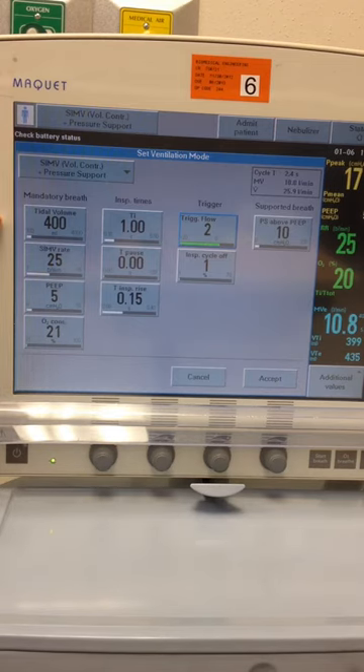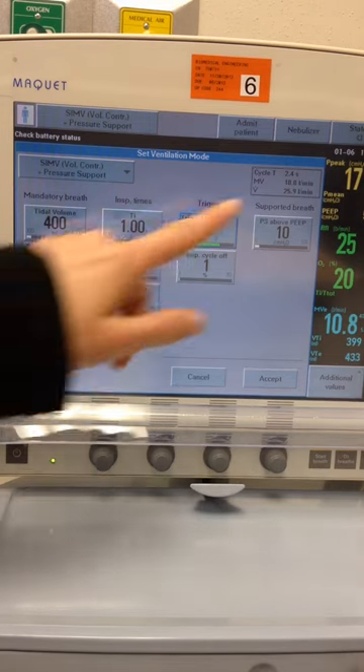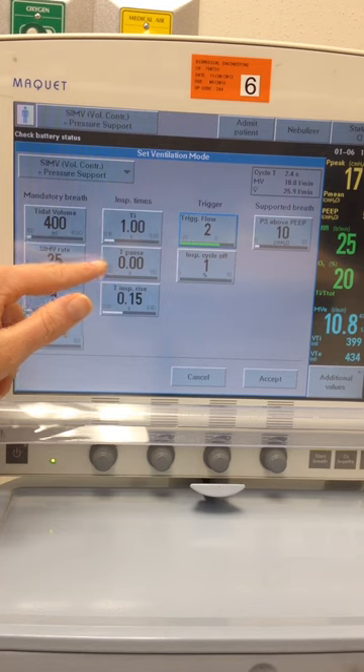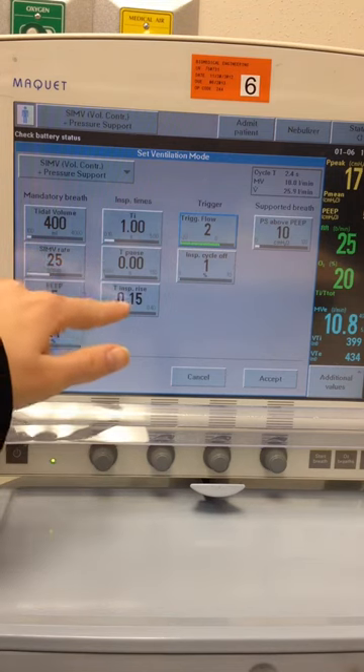So SIMV volume: tidal volume of 400, rate of 25, FIO2 of 21%, PEEP of 5, pressure support of 10, I-time of 1 second, and the inspiratory hold at 0 seconds. We can leave our inspiratory rise at 0.15.